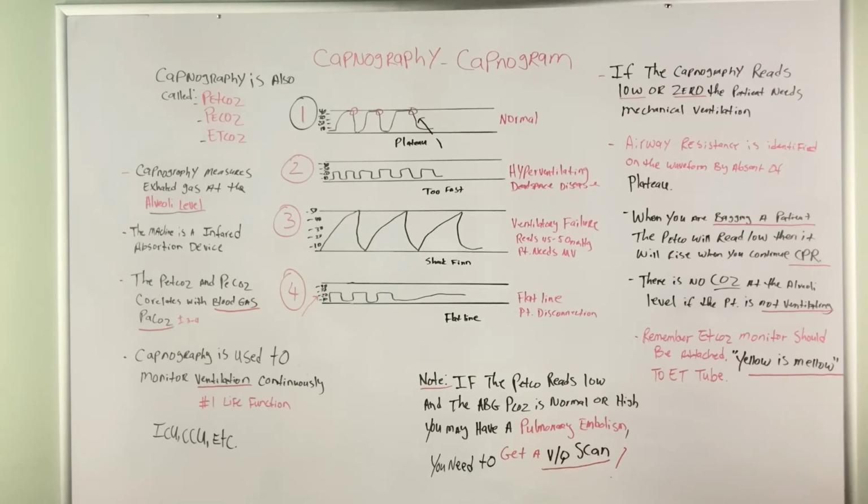To the left of the board are some things that you should remember and will see on the exam. Capnography is also called PETCO2, PeCO2, EtCO2. Now, NBRC may not use the word capnogram or capnography, so you need to be aware of that and don't miss that on the exam.